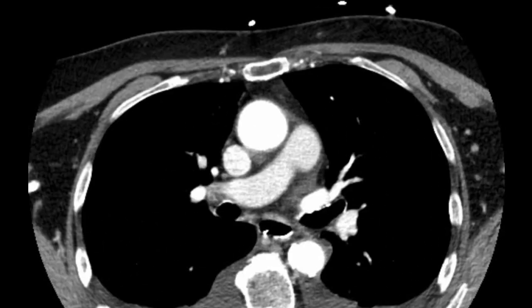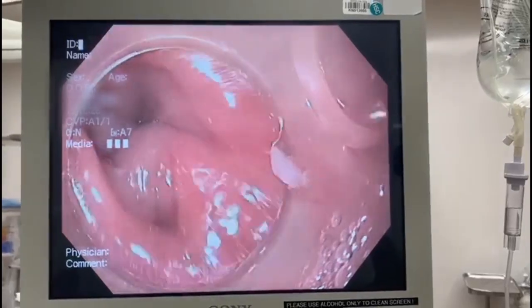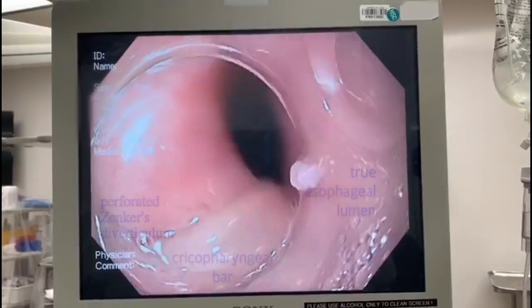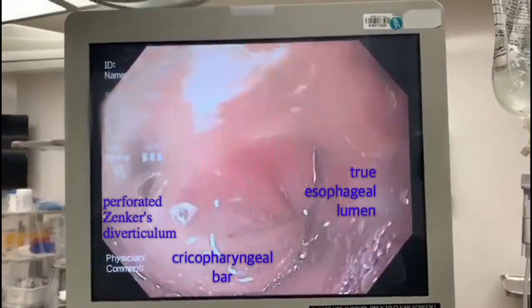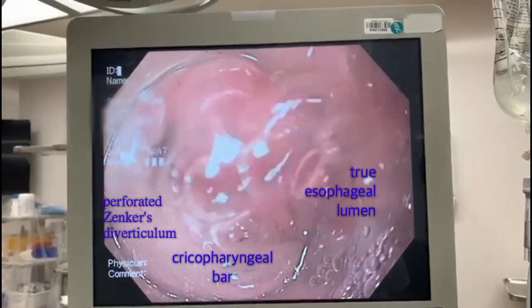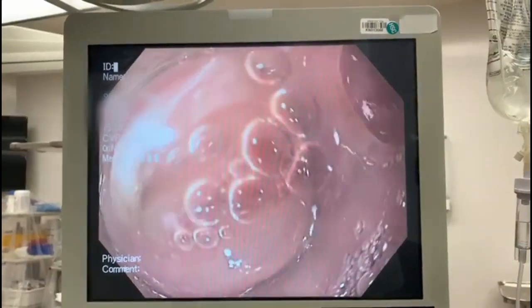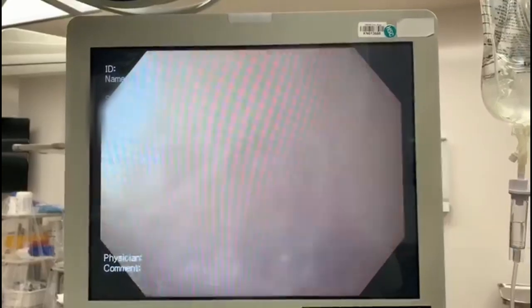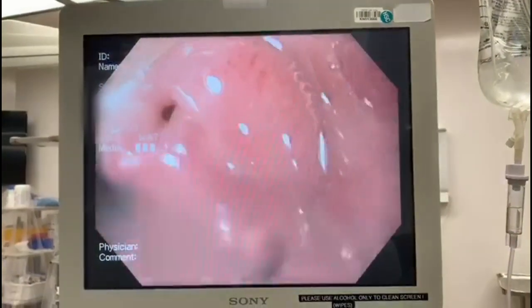She was taken back to the operating room with a plan for gastroscopy followed by repeat neck exploration. On gastroscopy, with the aid of a clear endoscopic cap, we identified a small Zenker's diverticulum with a perforation. This is seen on the left and the true esophageal lumen on the right.